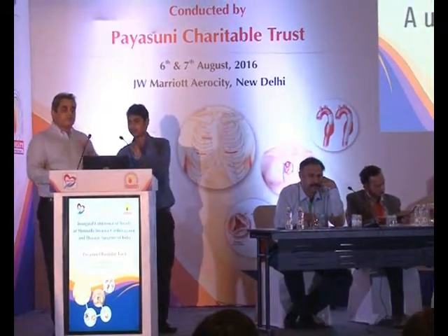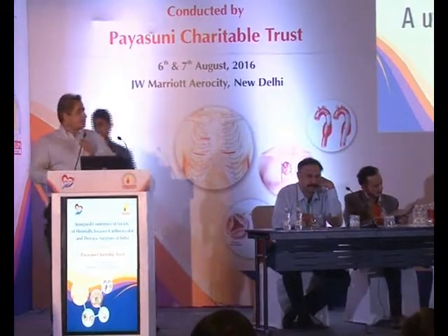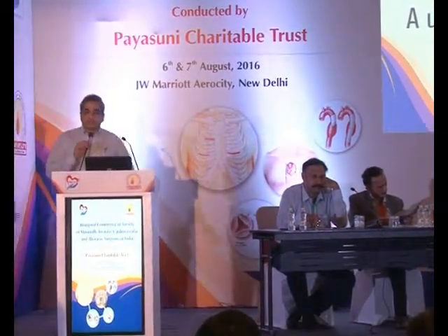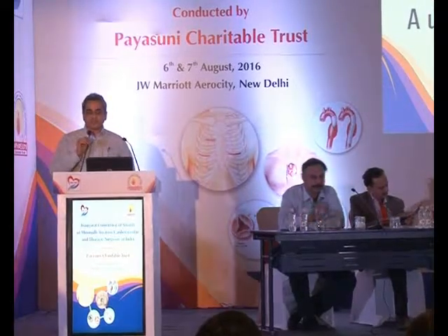A lot of them have obviously been previously treated because it's an emergency and the treatment has been done, but then the arch starts expanding, the descending thoracic expands, and then we normally need to go in for a redo surgery, which adds to the morbidity. So this is a case which I'm going to show you.